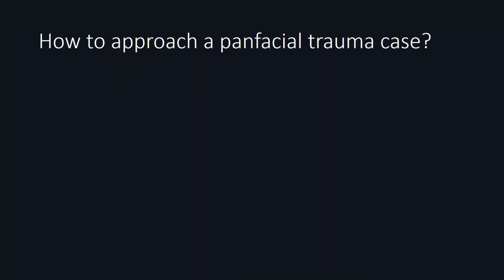So how do you deal with a Panfacial trauma case? First, when you deal with such a complex problem, it can be overwhelming. Especially when dealing with a Panfacial case, the first thing I like to do is identify all the fractures that I see on imaging. And then you also want to think about what are the unforeseen problems that may not seem as obvious at the moment.